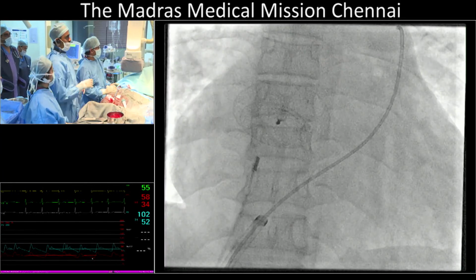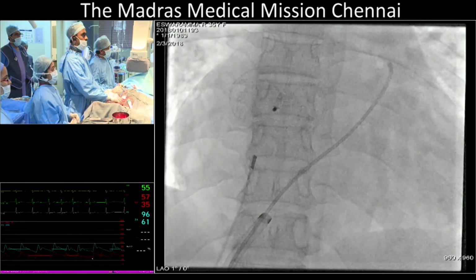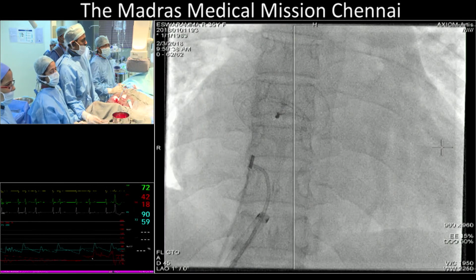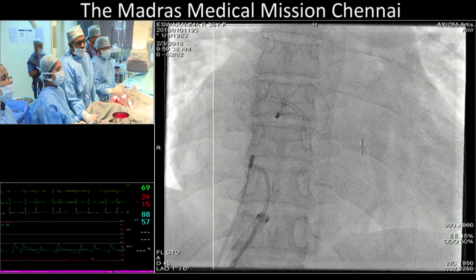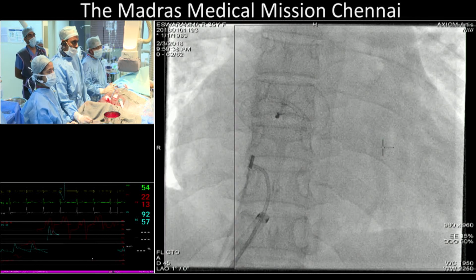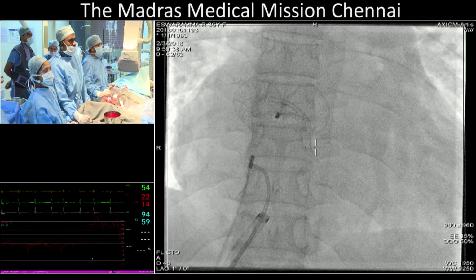We found it useful to pass a catheter and tip deflector and fix it with the tip-deflected catheter, to reform the device and fix the cobra or abnormal position of the left atrial disc.